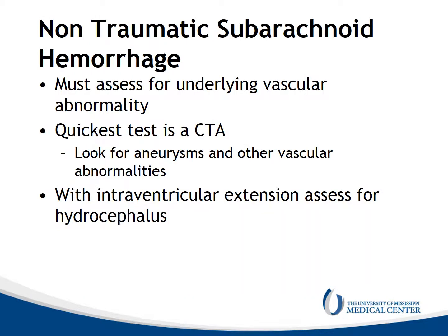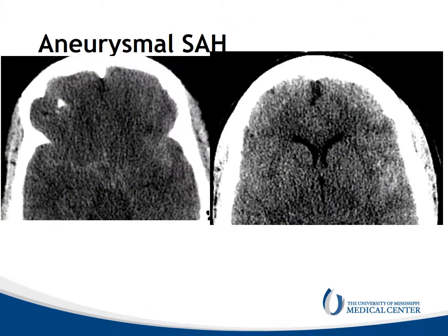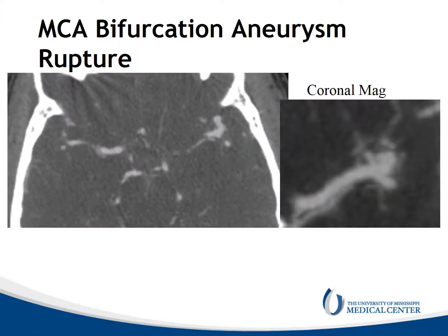Non-traumatic subarachnoid hemorrhage must be assessed, and one needs to look for an underlying vascular abnormality. The fastest test is a CTA, looking for aneurysms or other vascular abnormalities. If there's intraventricular extension, assess for hydrocephalus. Here we see hemorrhage in the suprasellar cistern and extending into the sulci in the region of the left sylvian fissure. This was non-traumatic. CTA was performed and showed abnormality at the left middle cerebral artery bifurcation — this is a ruptured MCA aneurysm.